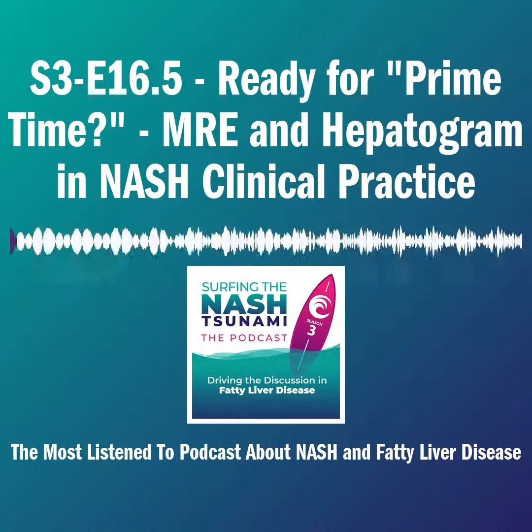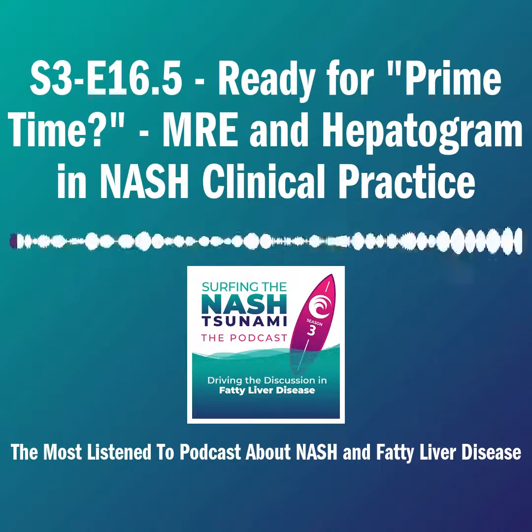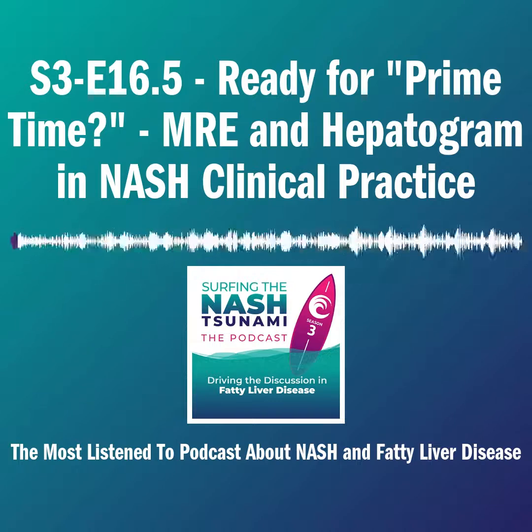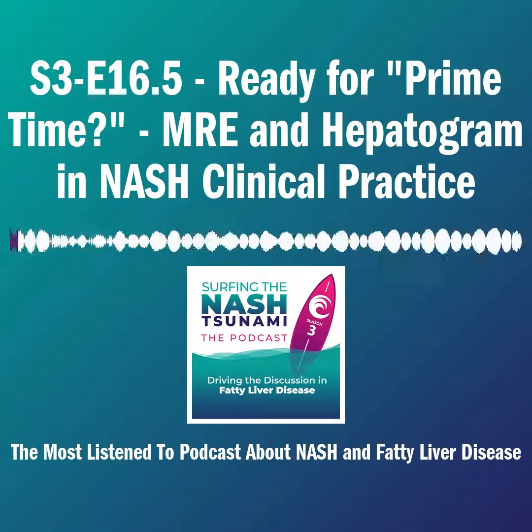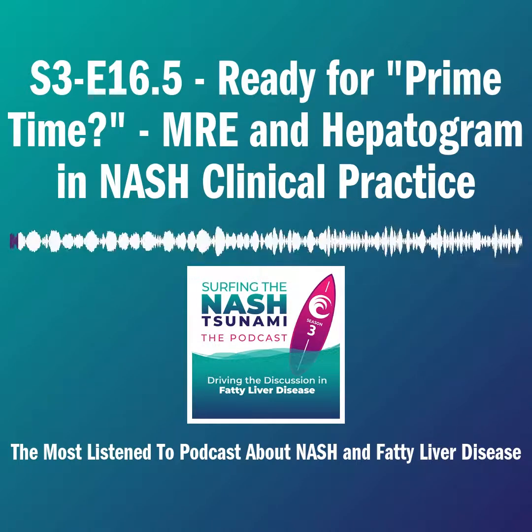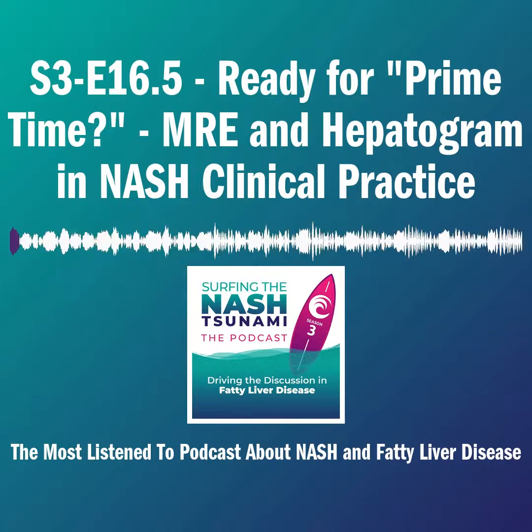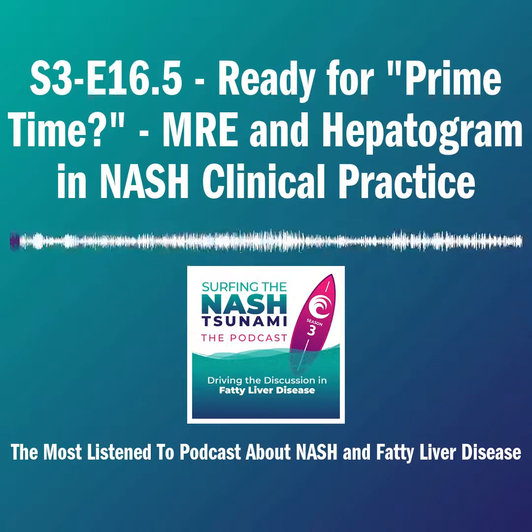To start, Mazen Noureddin discusses how he came to explore the idea of a MAST score after reading the original FAST score paper. He wondered what would happen if we replaced FibroScan in those computations with MRE plus MRI-PDFF, which provide more precise results. He found several different promising outcomes from working with MAST, which he describes in this conversation.